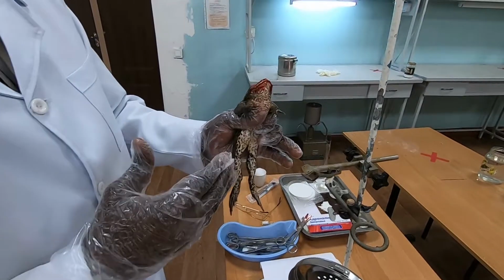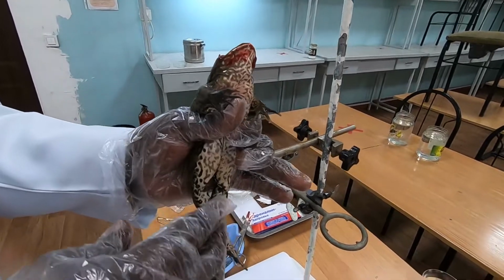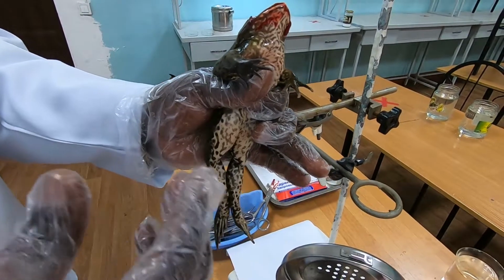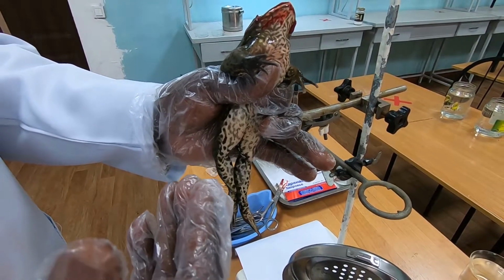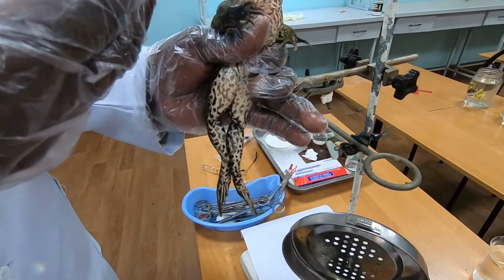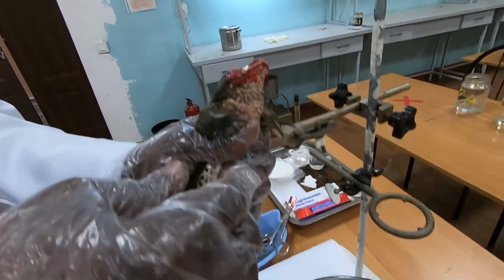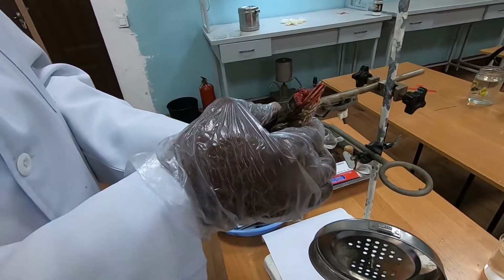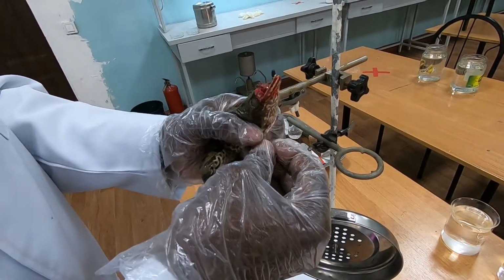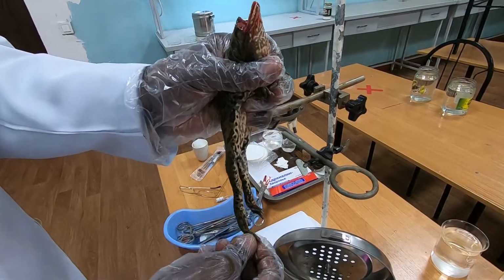Dear students, you can see the frog is in a shock. You see, that's why it cannot move very well. It's still in a shock. After some few minutes, you will see that it will regain its energy. Okay, it will get out of the shocking condition, right? And it will begin to shake very hard. Okay, so this is what we do. We just leave it for some few minutes and see. You see, it is still in a shocking condition.